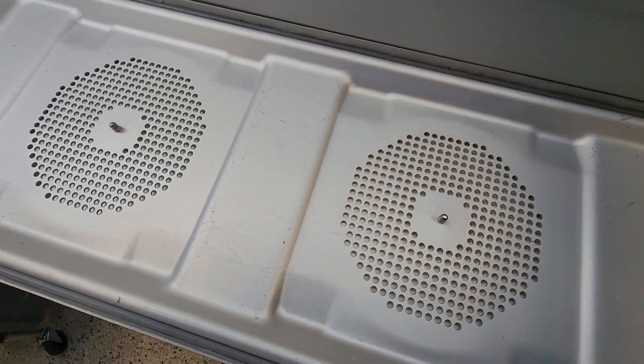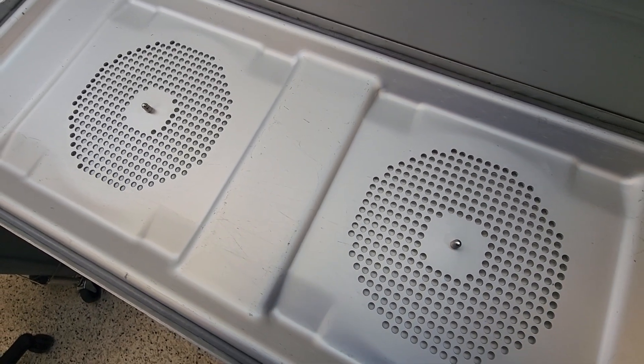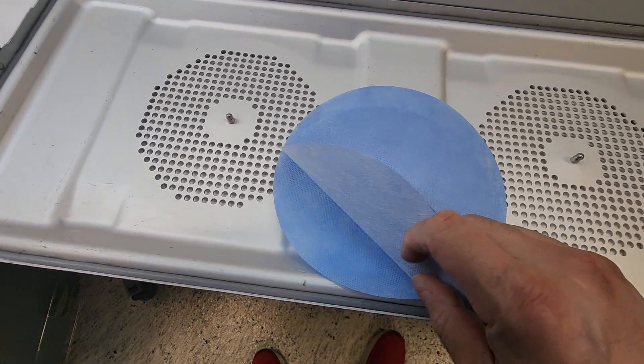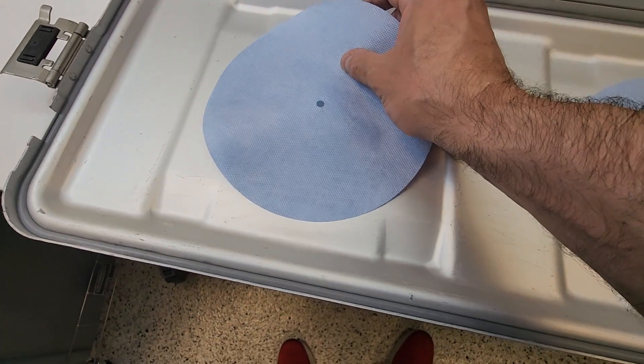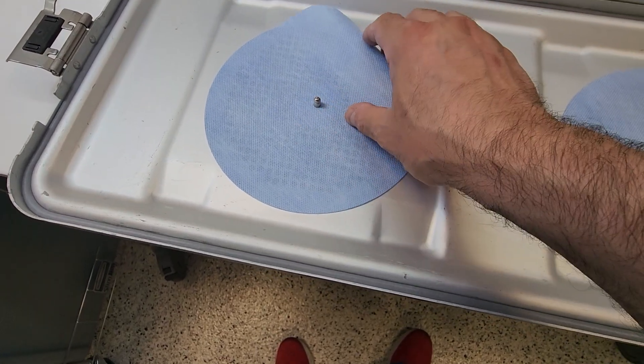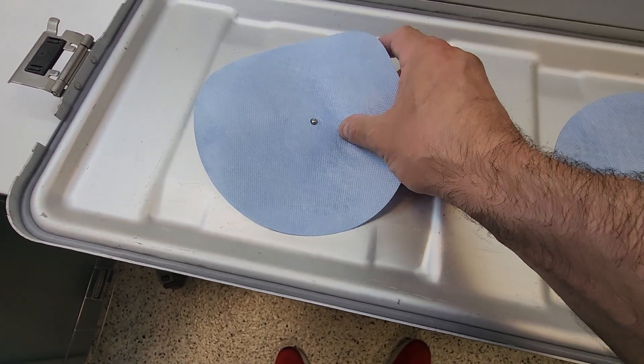Next are our filters. Ensure you are using the correct filters for the correct type of sterilization modality you are going to use. In this case, again, we are using pre-vacuum cycles. Always inspect your filters.